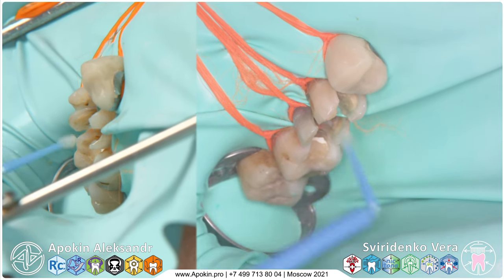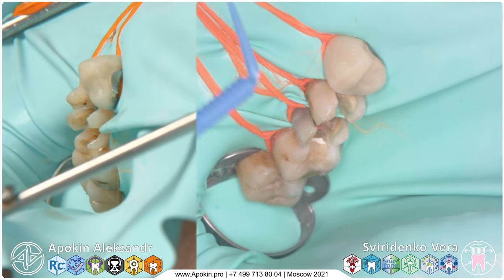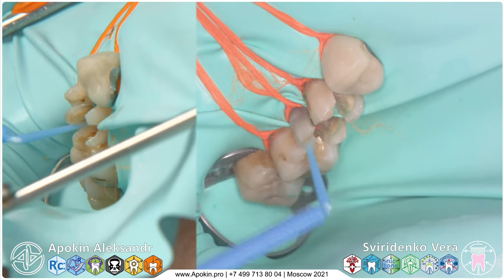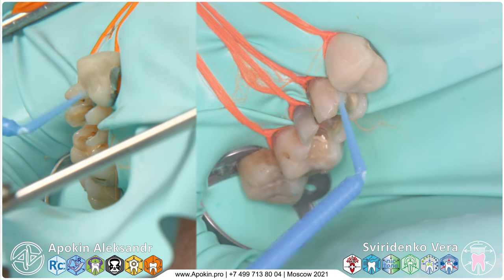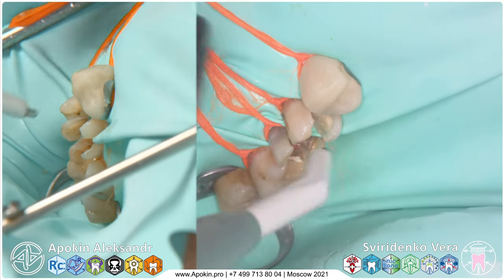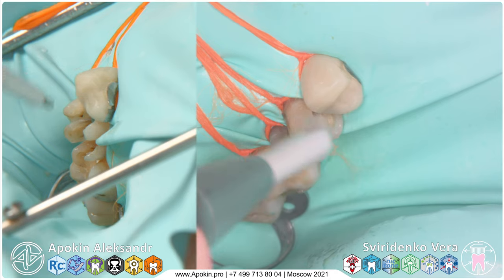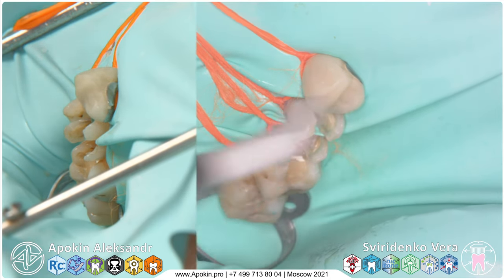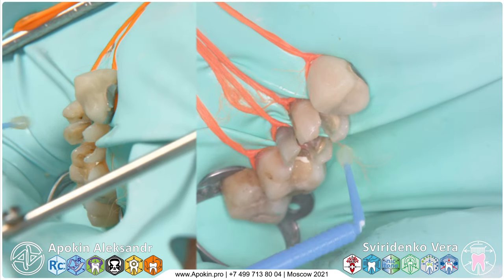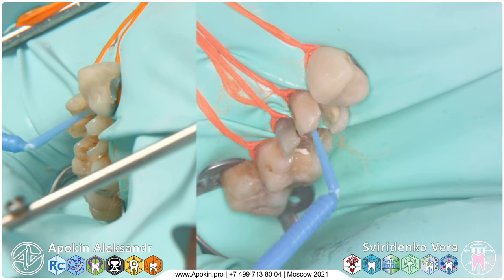We cover all surfaces with a primer. The second agent is bond. We blow the first primer with the air very carefully. And then continue with bonding.